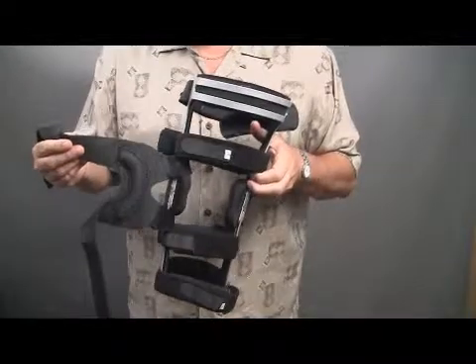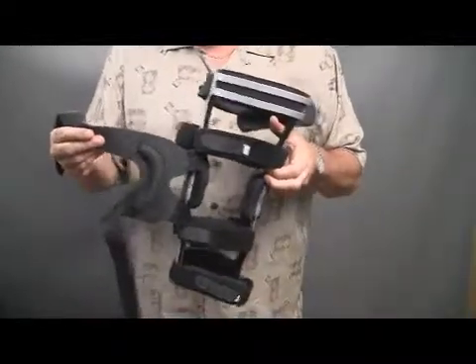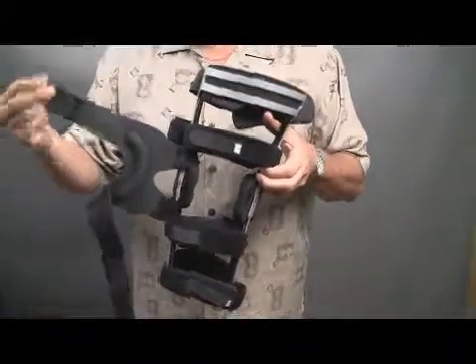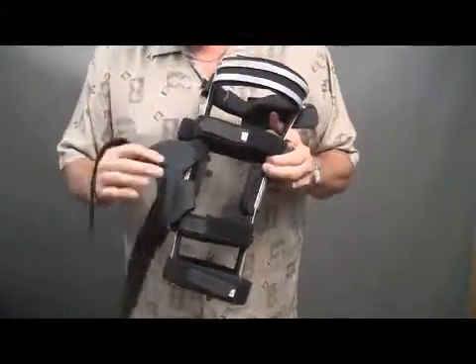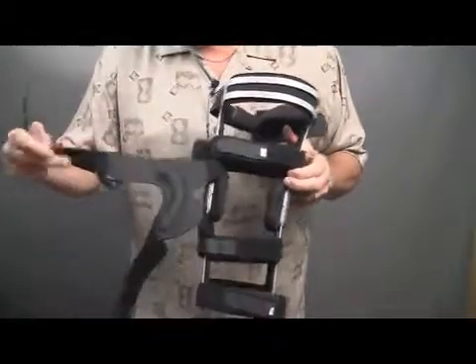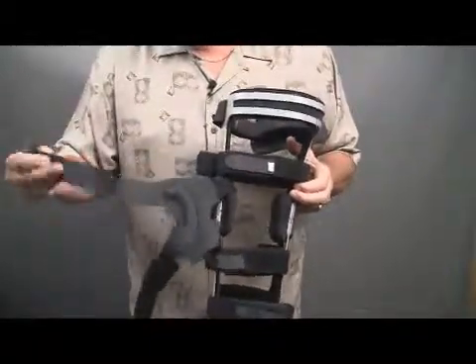This patella strapping system is our K196. It's not the whole brace — it's just the strapping system that I'm holding here. It has a tubular rubber buttress in a C shape, attached on four arms with a terry type cover.